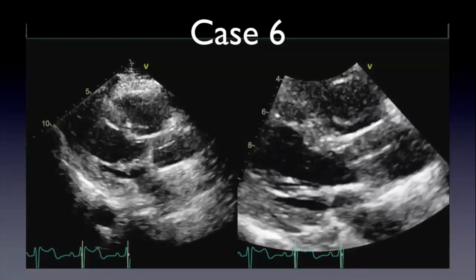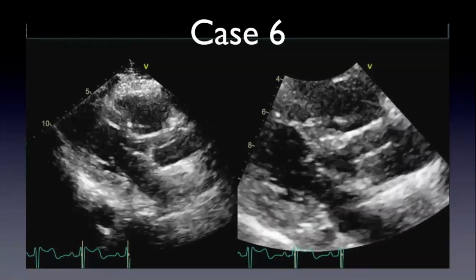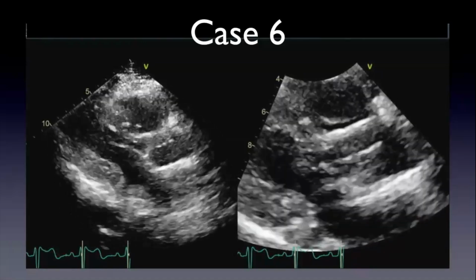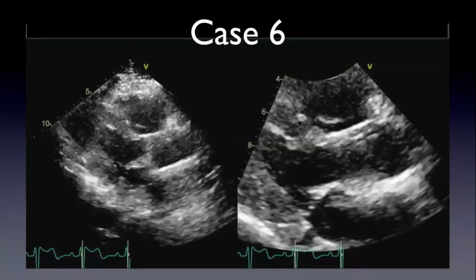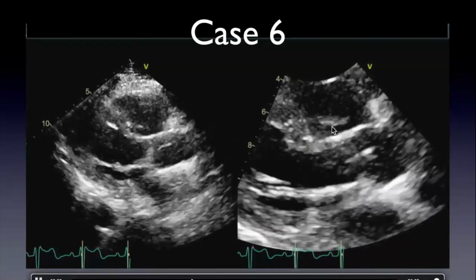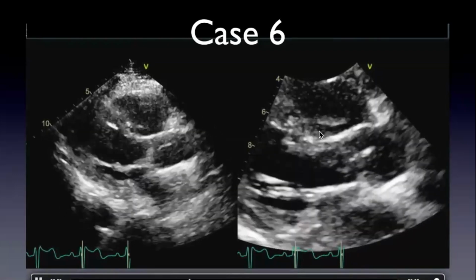Okay. Anything else you see? Not sure what that is. Or is that artifact? I mean, there is right above sort of the superior graft edge there in the RVOT, I see something linear as well. That's kind of at a different angle. Yeah. So maybe here. Hold on. There's two arrows here.